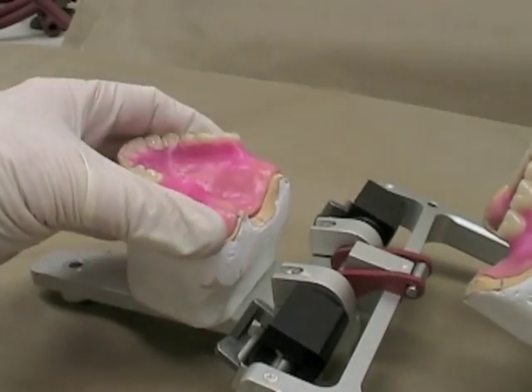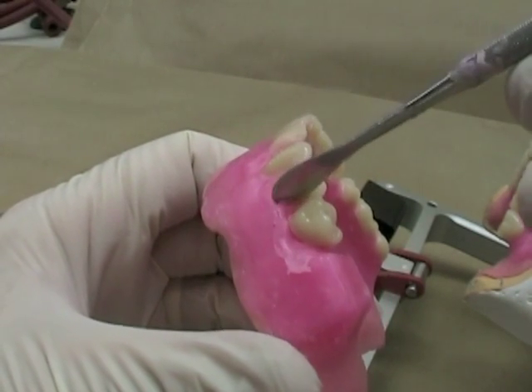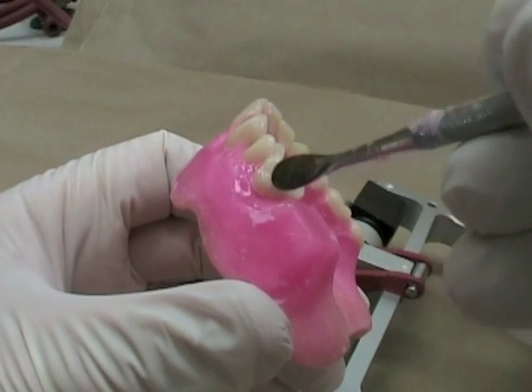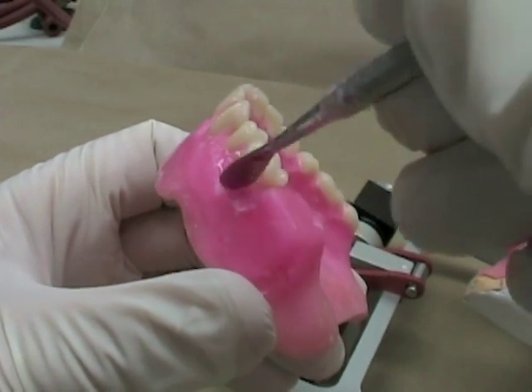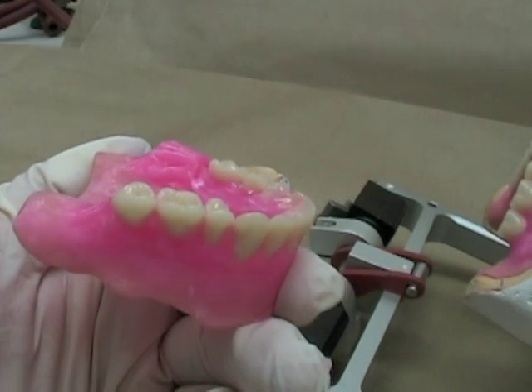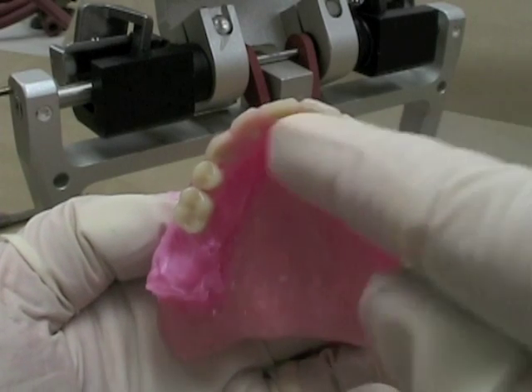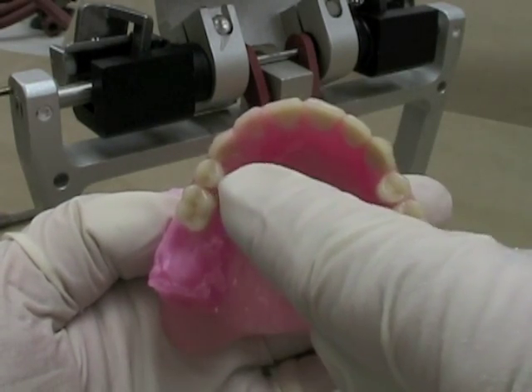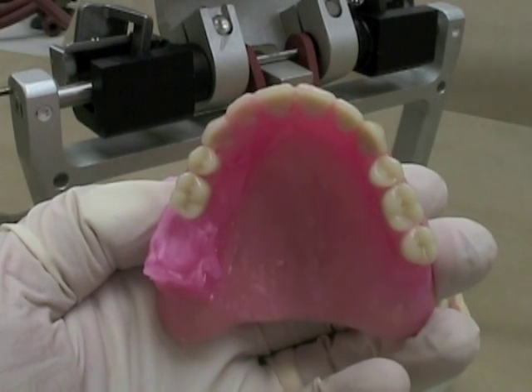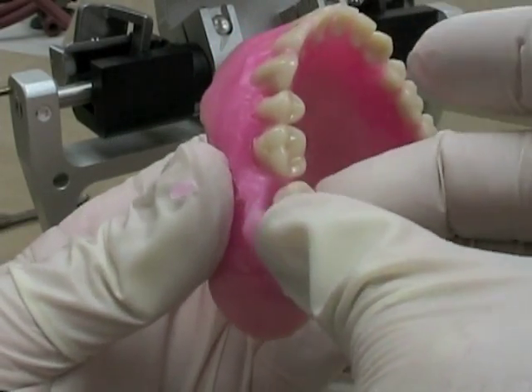So that molar looks good. I'll take that off, soften the wax around there, and then I have one more molar to set. Before I place my second molar, just taking a look from the occlusal aspect to make sure again I'm following around the arch. I don't see any of my posterior teeth either too far buccal or too far lingual/palatal in comparison to the rest of the teeth. So I'm going to go ahead now and place my second molar.